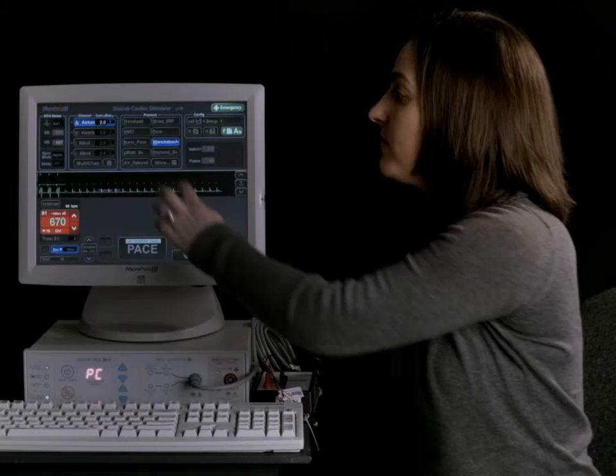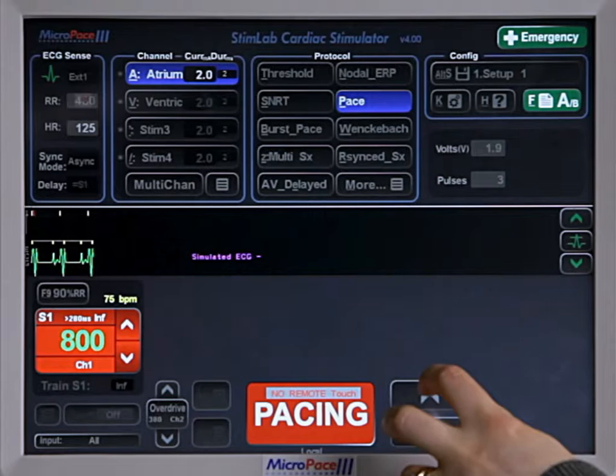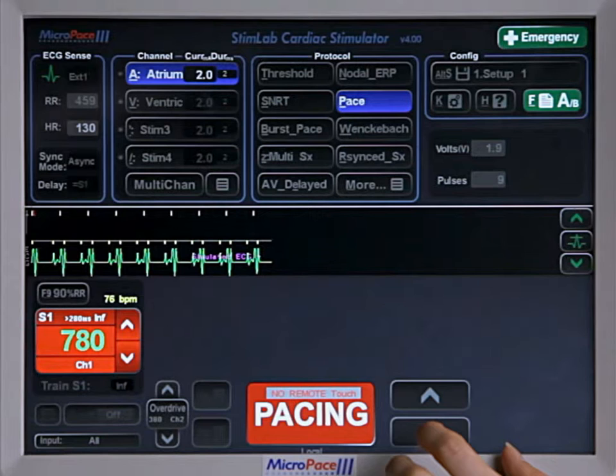In that case you can just go to the pace protocol, start at 800 milliseconds as you would with the Wenckebach, start pacing, and then just manually decrement the S1 every three beats or so. Then when you get Wenckebach, simply stop pacing.